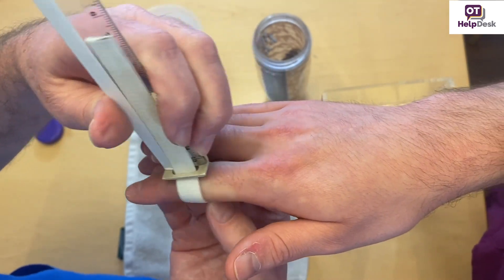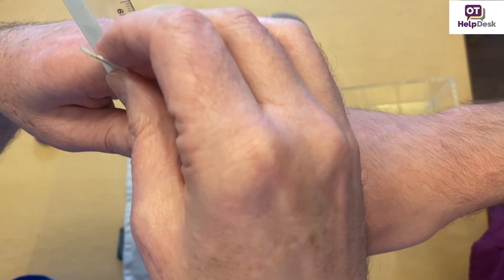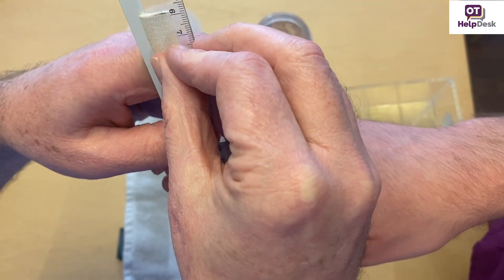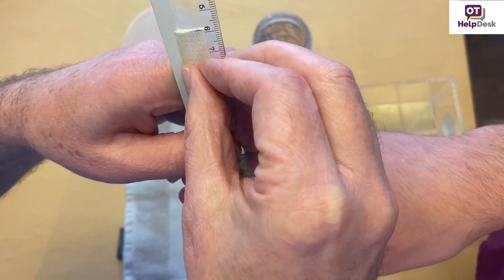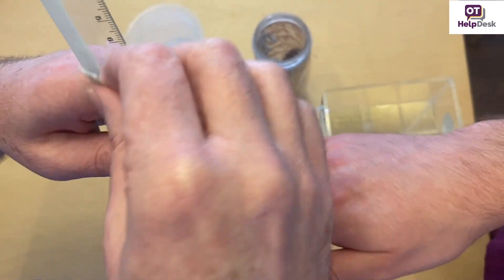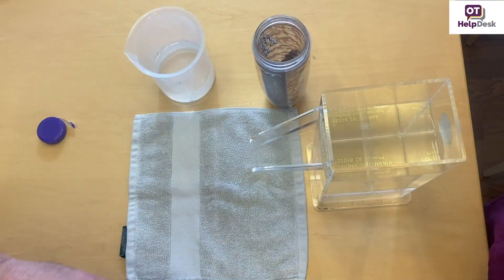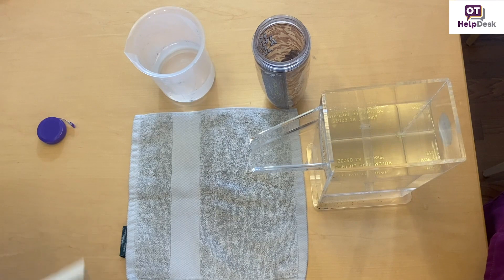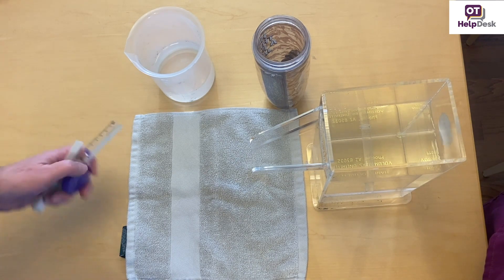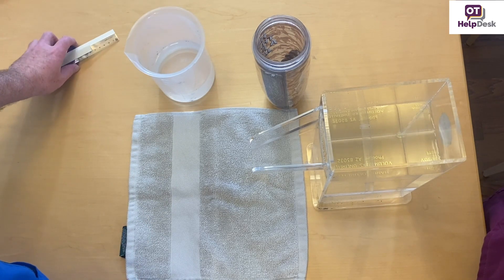Then we move it out, and you would logically see this get smaller. This one here is about 5.8 for the middle phalanx. And then you would go to the distal phalanx and do the same thing — it's about 5.2. So you would measure each one of the fingers. Now that takes a little bit of time to do, and these are okay and they're quick.